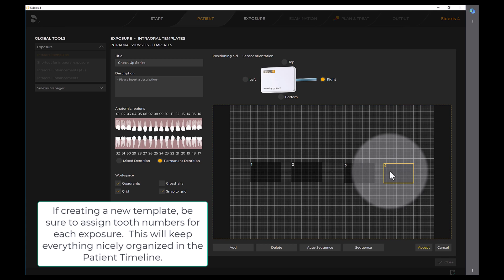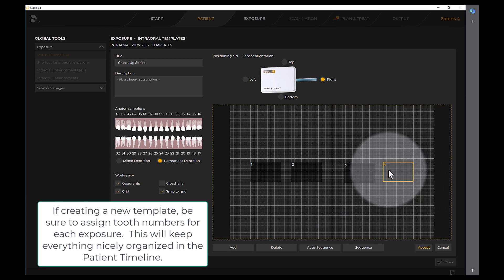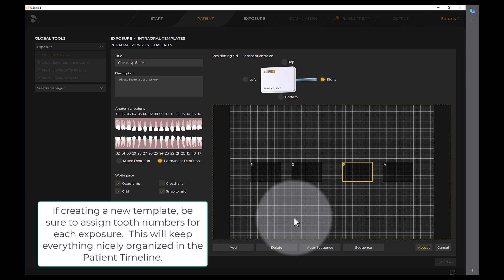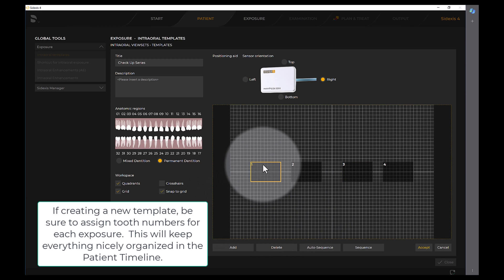If creating a new template, be sure to assign tooth numbers for each exposure. This will keep everything nicely organized in the patient timeline.